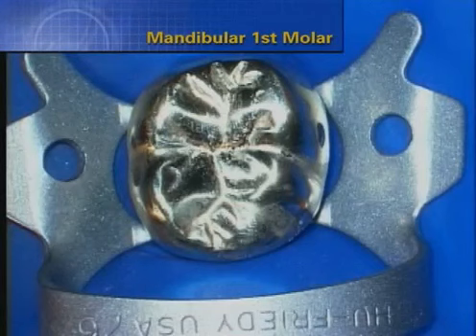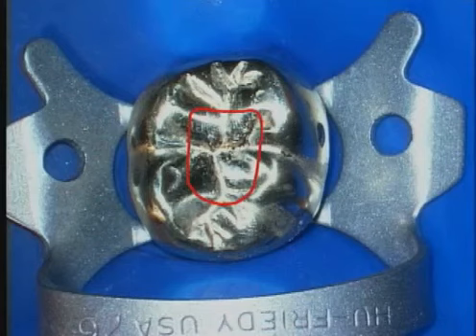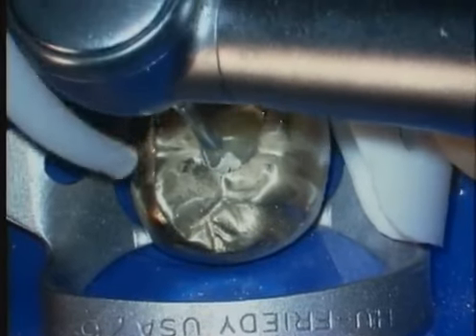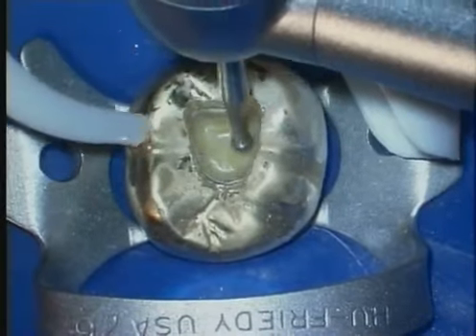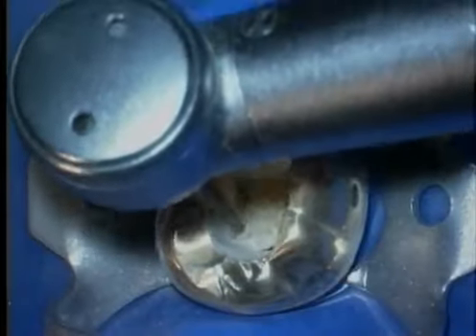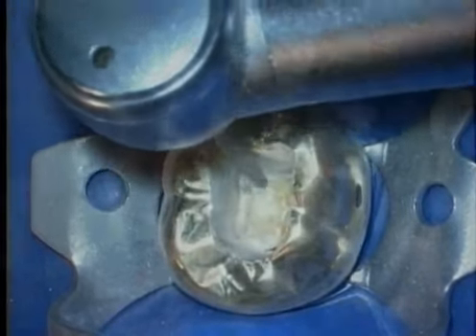Looking at the occlusal view of the isolated tooth reminds me of an old expression: start with the end in mind. The outline pattern can be used to guide our clinical actions. We select a transmetal burr because we're accessing through a metallic crown. The round burr sweeps like a brush to remove dentin. A tapered diamond smooths up and refines the axial walls.